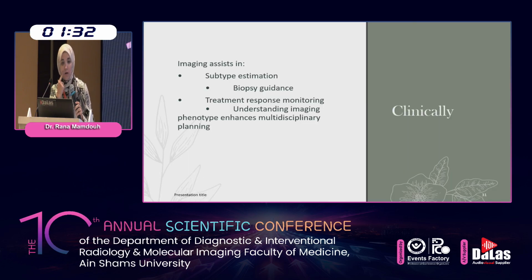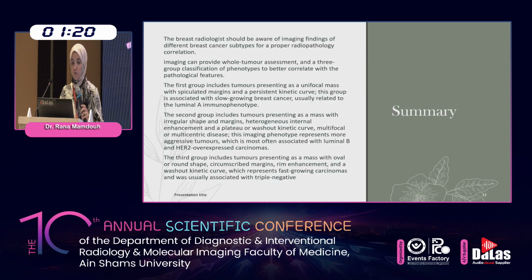Clinically, imaging assessment and subtype estimation, biopsy guidance, treatment response, and understanding imaging phenotype enhanced multidisciplinary planning. To summarize, the breast radiologist should be aware of the imaging findings of different breast cancer subtypes for proper radiopathology correlation. Imaging can provide a whole tumor assessment and a 3-group classification of phenotypes to better correlate with the pathological features.